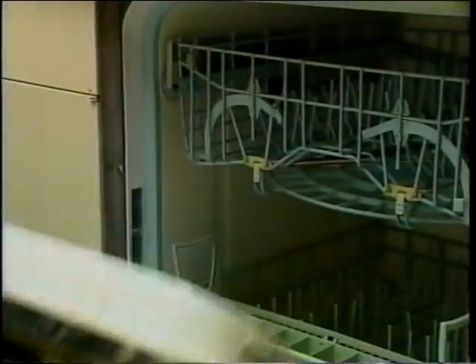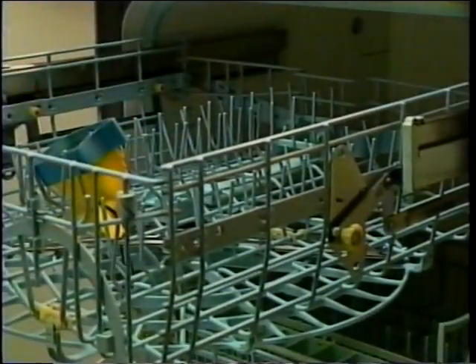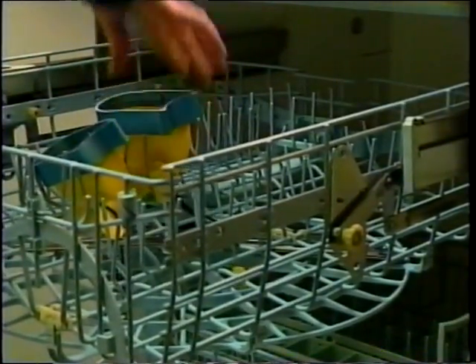The first two tubs may be replaced with a washing cycle in an automatic dishwasher. Simply place the mouthpiece face down in the dishwasher.